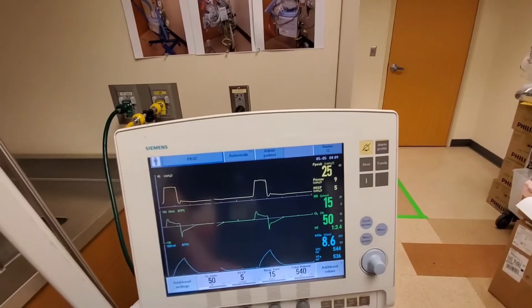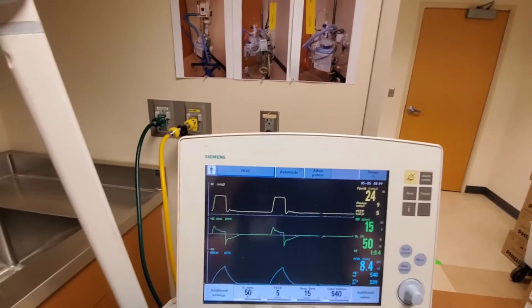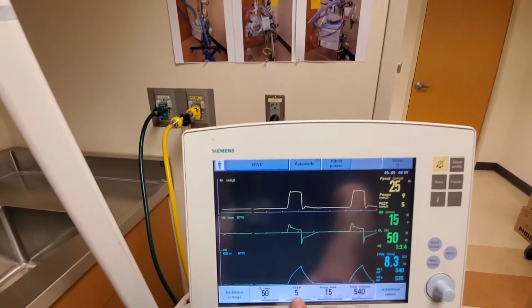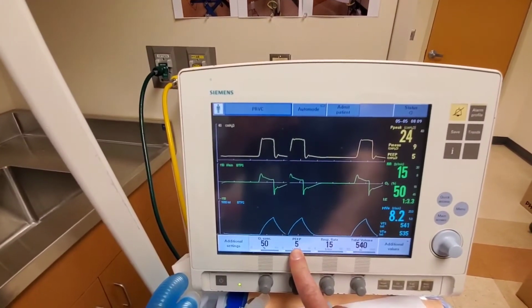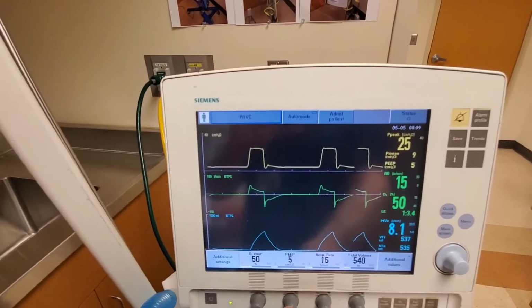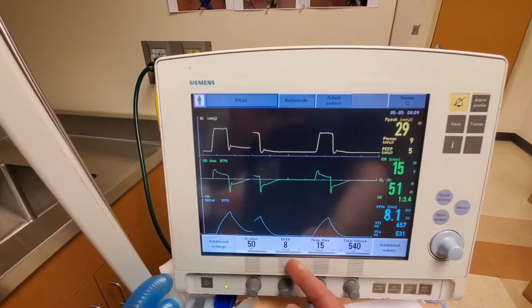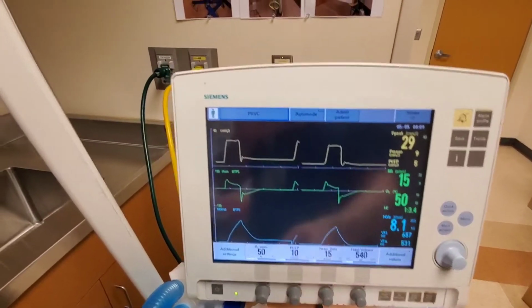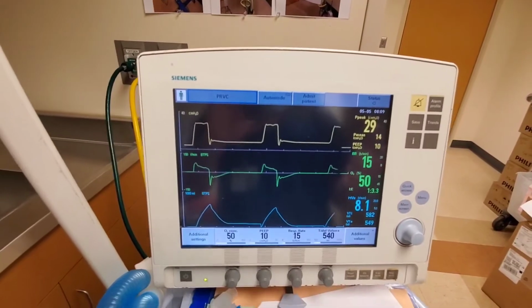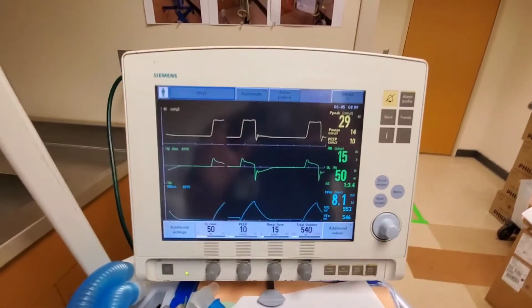There are parameters for terminating or not doing your therapy that are listed on your list. So one is PEEP. If the PEEP is too high, it's getting more common that we put patients on PEEP of 8 that are obese at least. So you would see it like that. But on the sheet, it says a PEEP of 10 is a time to hold therapy. If the patient's obese and they're on a PEEP of 10, I wouldn't be as concerned about that.